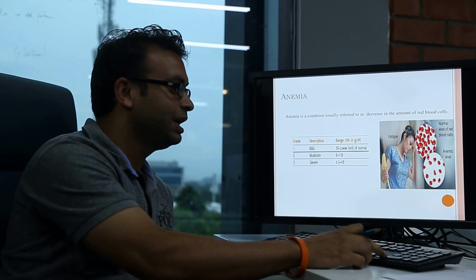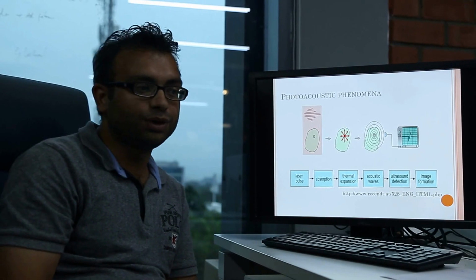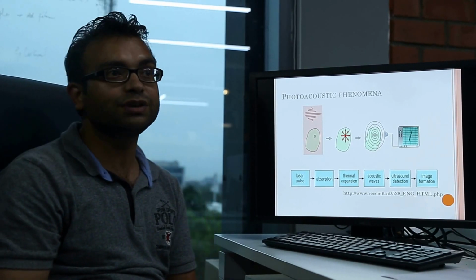Hi, we are Team Trosha and we'll be working on non-invasive, on-the-go, low-cost and scalable methods for diagnosing anemia. We know that anemia is a prevalent disease or symptomatic condition worldwide. So for this problem, we have decided to use the photoacoustic phenomenon.